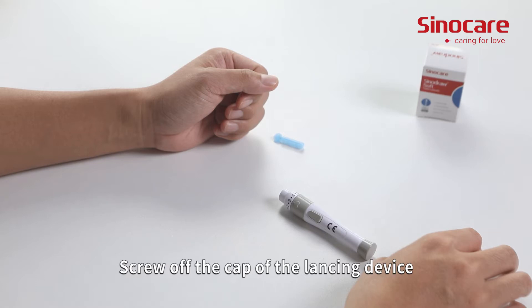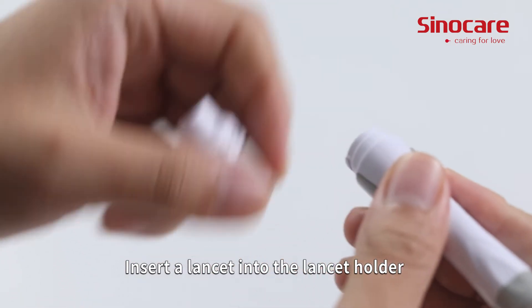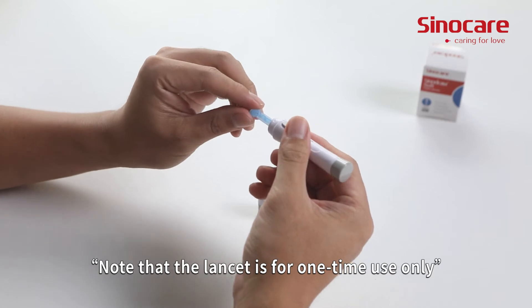Screw off the cap of the lancing device. Insert a lancet into the lancet holder and push down until it is fully seated. Note that the lancet is for one-time use only.